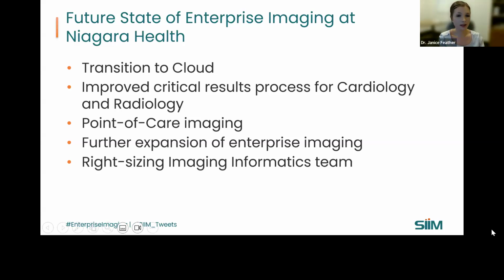Amazing, thank you. And then for folks who are doing that work, I think there's also that great lesson learned, that many times different organizations do their procurement in different ways. There have been ultrasound units ordered for our cardiology program that we find out about like 6 months after they've been here. So really ensuring that our informatics professionals are involved in some of the procurement decisions, so we can make the right decisions right off the hop in terms of what those integrations look like in our Sectra solution. Certainly that has been some continued work that we have to do with our other departments across our organization.